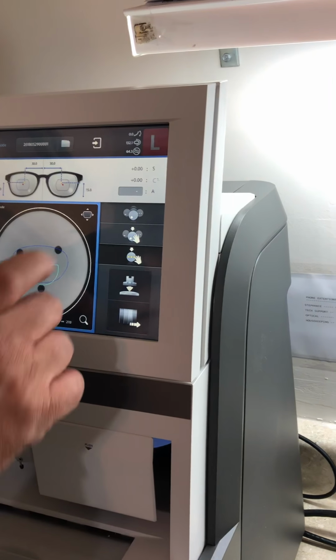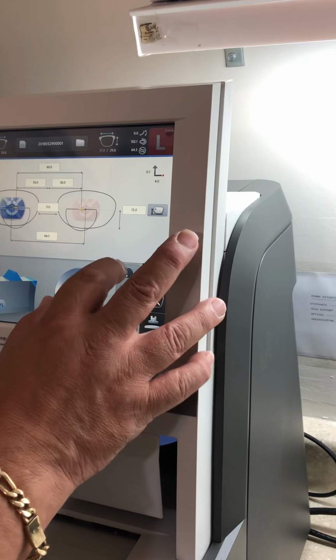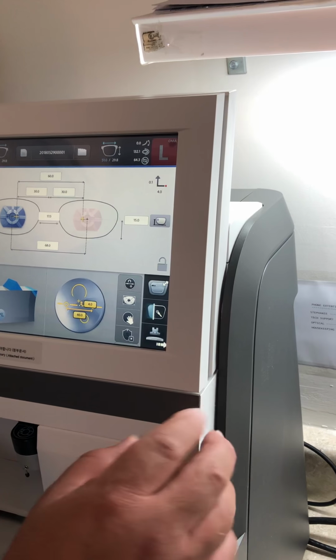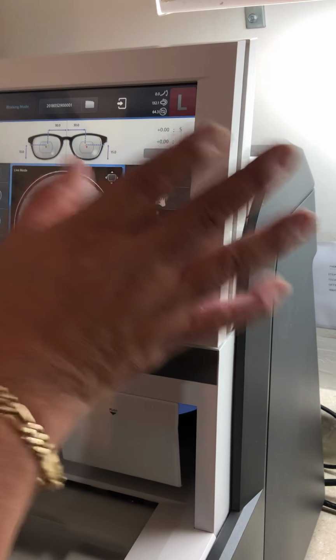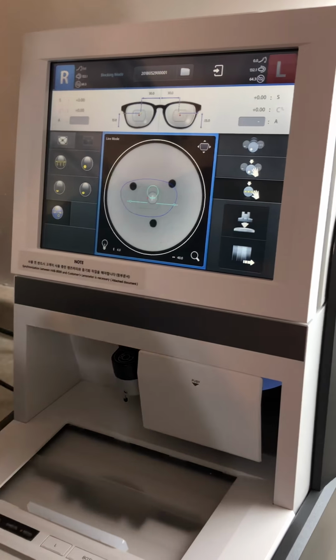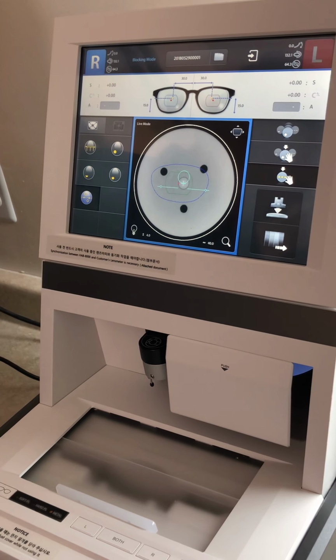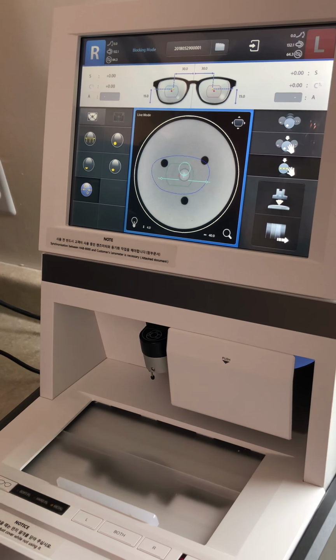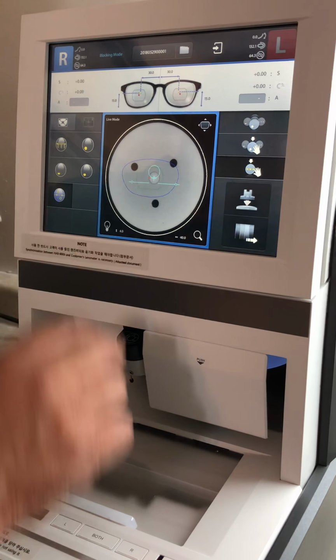When you have a manual mode, you actually see the description of it. If I had a progressive, now y'all do a lot of digital, and you don't have all the markings. I recommend that you go ahead and block those in manual mode, because all you're going to be looking for is the engraving, and you're going to be putting the engraving.